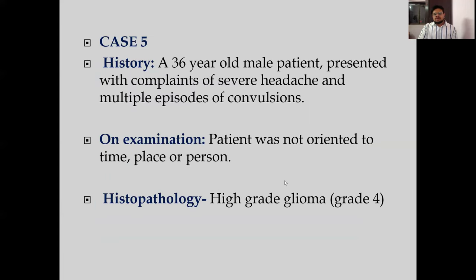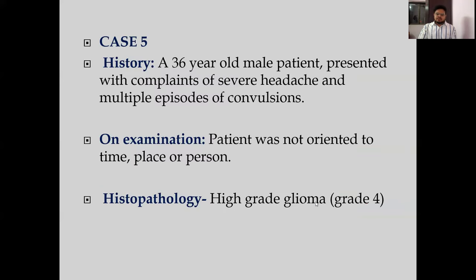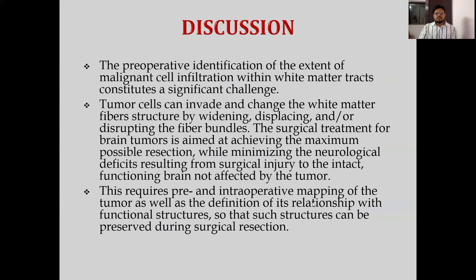Case 5: a 36-year-old male presented with complaint of severe headache and multiple episodes of convulsions. The patient was not oriented to time, place, or person. Imaging revealed an ill-defined solid cystic, T2/FLAIR hyperintense, ring-enhancing lesion in the left temporal lobe. There was reduction in fractional anisotropy, and we can see there is complete destruction of the white matter tracts. Histopathology revealed a high-grade glioma, grade 4.